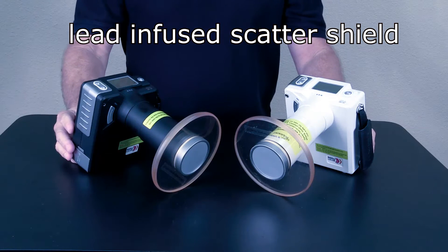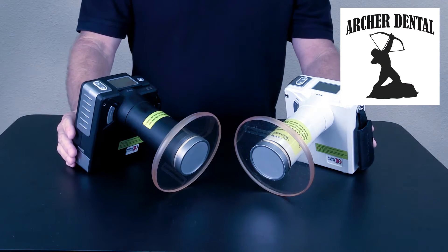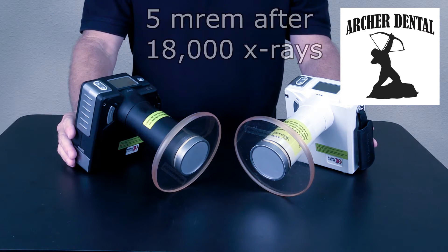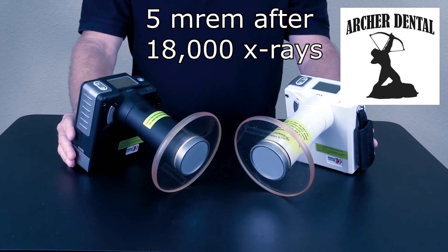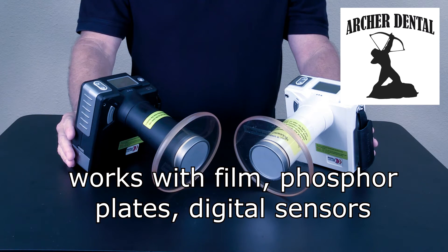A lead-infused scatter shield is included. The unit has an extremely low dose output of 60 kV, 2mA. Recent tests show total backscatter radiation to be only 5 MREM after 18,000 x-rays. For comparison, an airplane ride from Dallas to Chicago will give you more than 5 MREM of radiation.